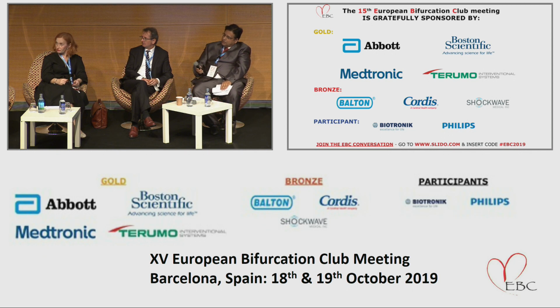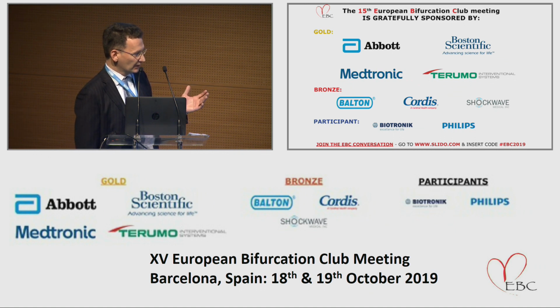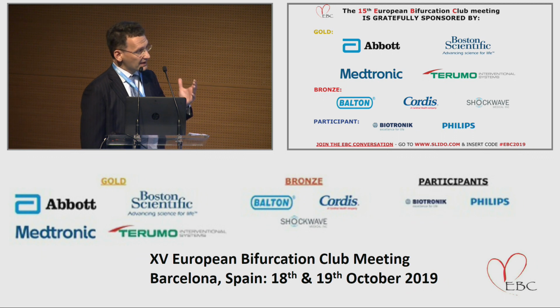I think the entire message conveyed by practically all of the speakers was the initiative of leave nothing behind. It's easier to imagine that would work for provisional plus DEB for side branch. It would be a little bit more tempting, as evidenced and proposed by Dr. Bonaventura, to propose it even for, let alone leave nothing in the vessel whatsoever, and treat even difficult and tempting bifurcations without any stent at all.